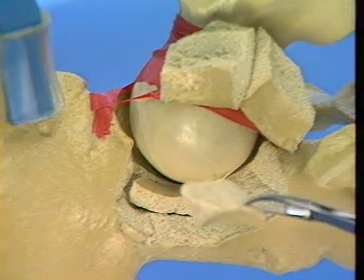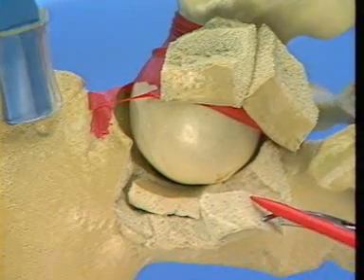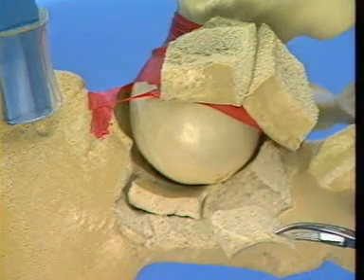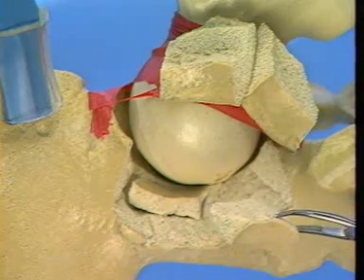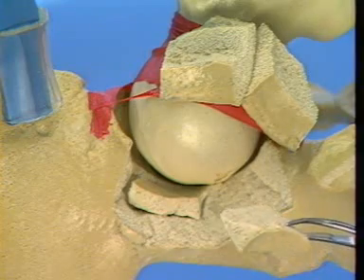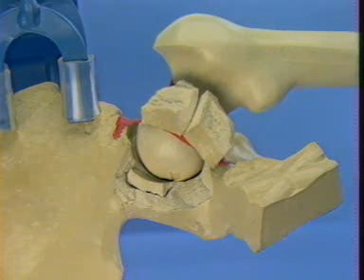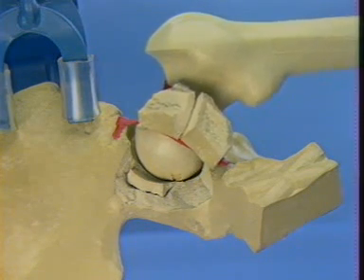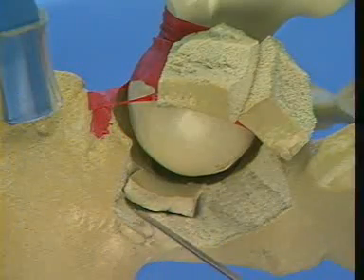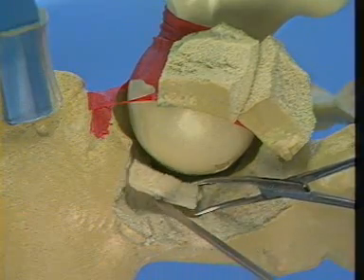An intra-articular free fragment is seen to be covered partially by articular cartilage and to be made up entirely of cancellous bone. This fragment should not be discarded and should be included in the final reconstruction of the joint. The femoral head was reduced into a congruous position with the acetabulum and used as a mold for reconstruction of the posterior wall. An osteotome is used to elevate the impacted segment of cartilage and cancellous bone.